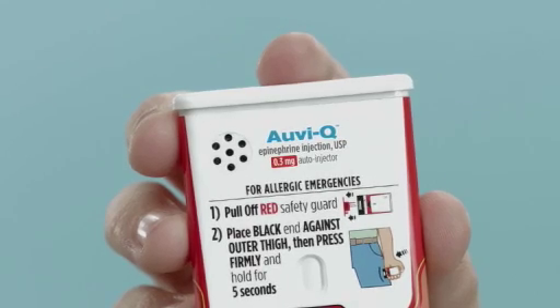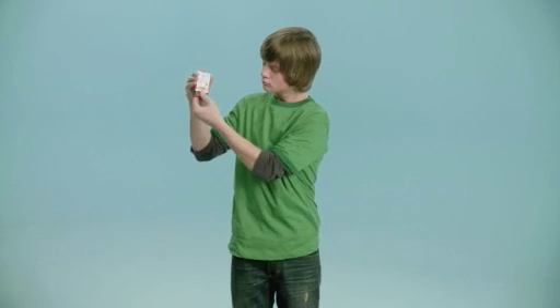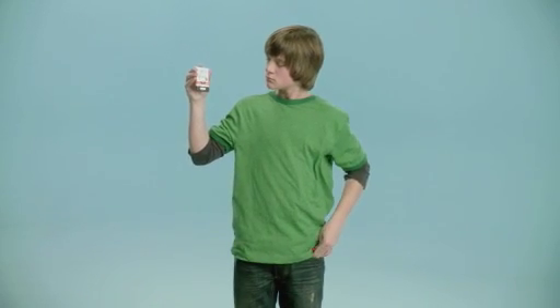If you are ready to use, pull off the red safety guard to inject. Place the black end against the outer thigh, then press firmly and hold in place for five seconds.